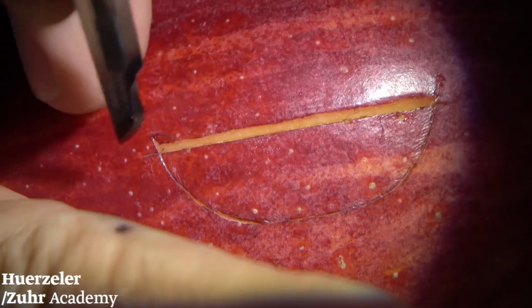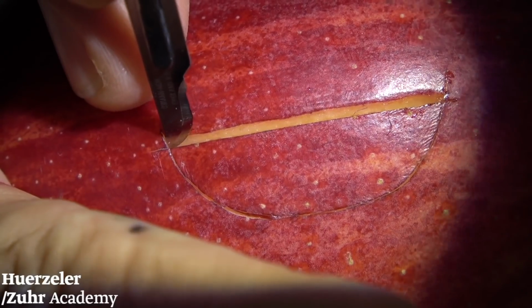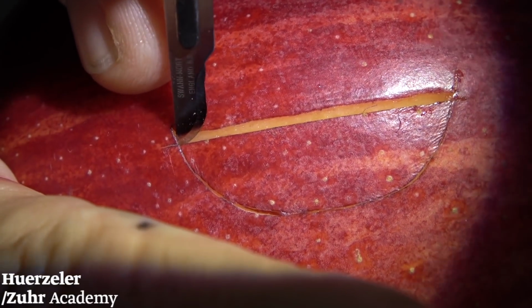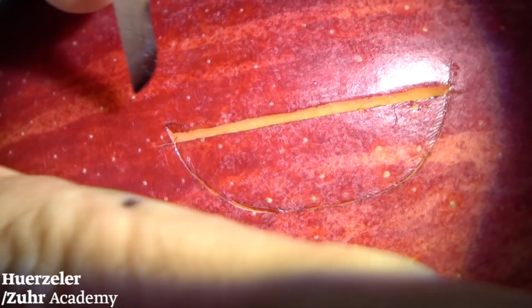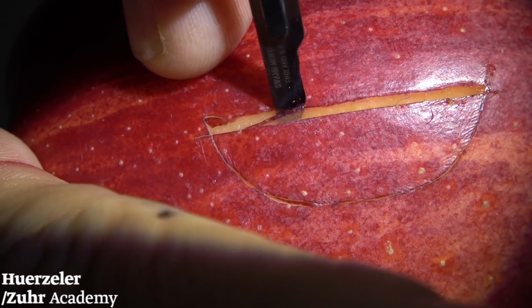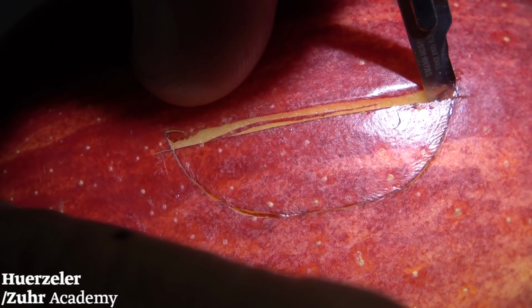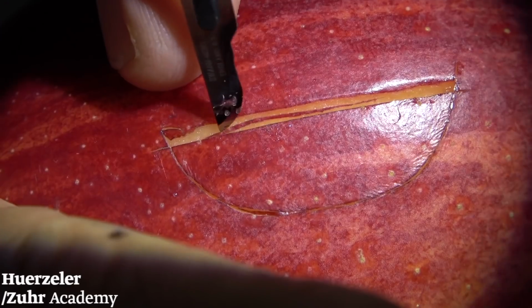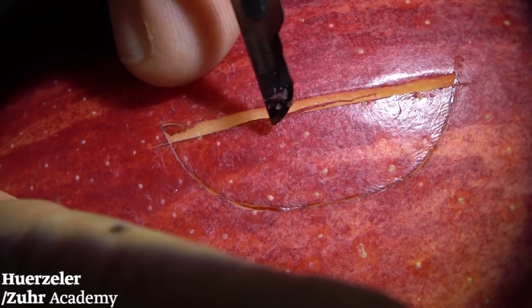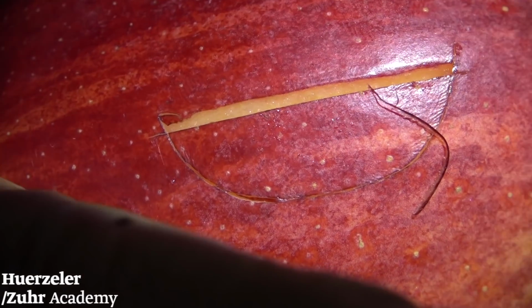So now we had 90 degree, we angulate our blade 30 degree, and now we angulate a little bit more, and we work only with the tip of the blade, and we try now to go around the corner very, very slowly. Here in the apple, the tissue is a little bit more rigid. That's why I cut here a little bit more off.